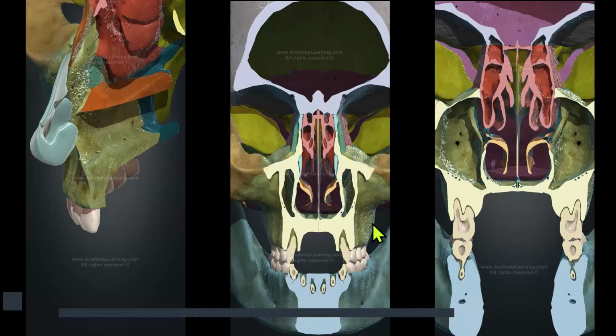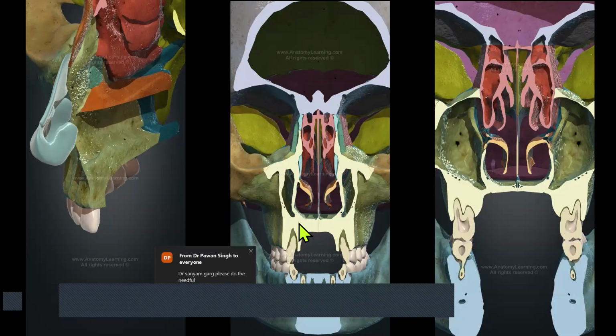Okay. In the premolar region, we have to see whether this bone is available here or not. Otherwise, when the sinus extends up to here, sometimes it is difficult for us to reach the nasal floor. Many times, the biggest target or difficulty in placing cortical or conventional implants is that we want to engage this nasal floor from this entry point, but if this sinus is pneumatized up to here, then it becomes difficult.